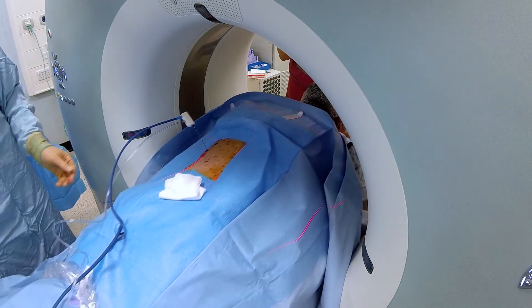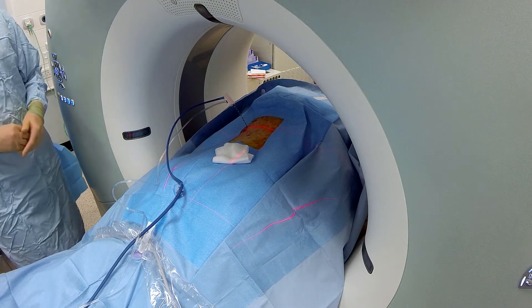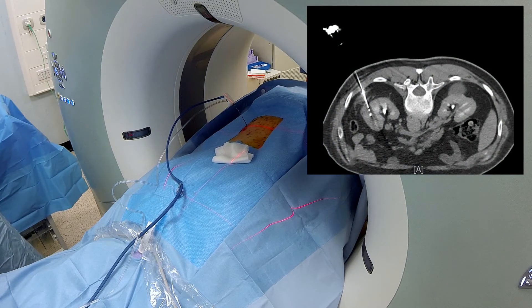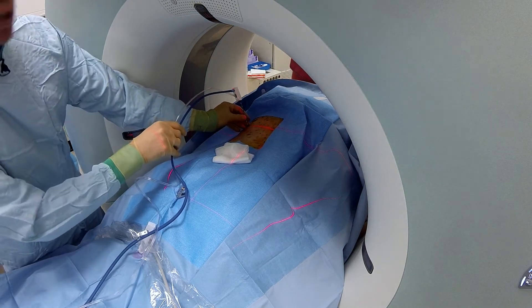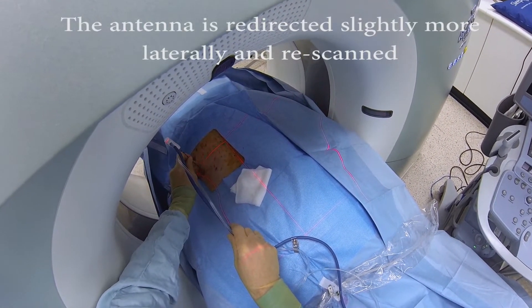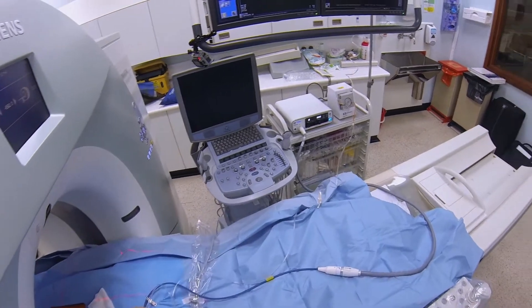Just going to move the table in. Breathe in for me now, breathe out, and stop breathing. Breathe away. So you can see the position is too medial there, so we're just going to redirect more laterally. Take a breath in for me now, breathe out, and stop there. Breathe away.